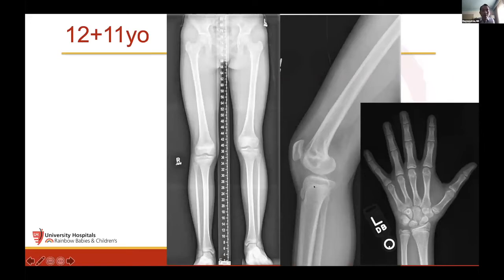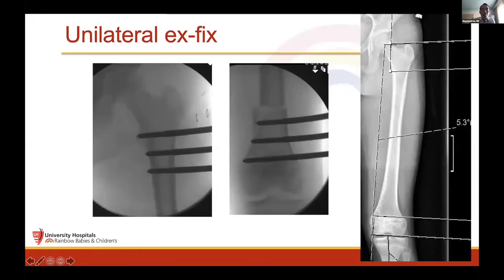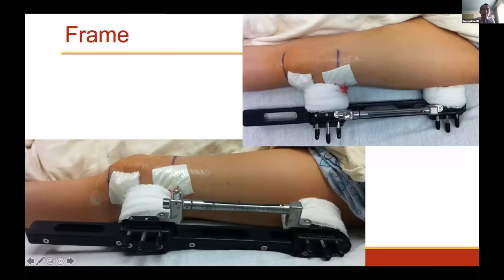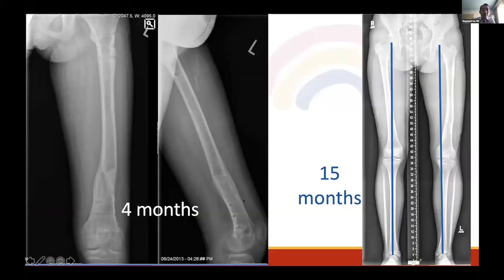So historically, if a child comes in like this with a growth arrest on the left side, a little bit of deformity, the reflex treatment is to do external fixator-based treatment. You can correct the varus acutely by putting the pins in. You can also correct any sagittal plane issues by putting in the pin angulated to each other. And when you put in the straight bar, you straighten out the sagittal plane. This gives a fairly reasonable result. At 4 months, this kid had pretty good healing and reasonable alignment. I wish I didn't have that varus.